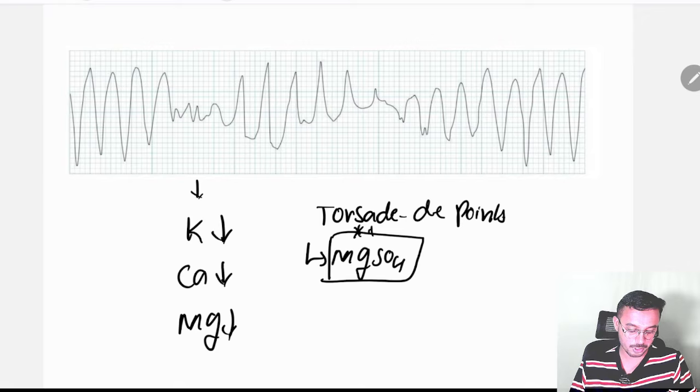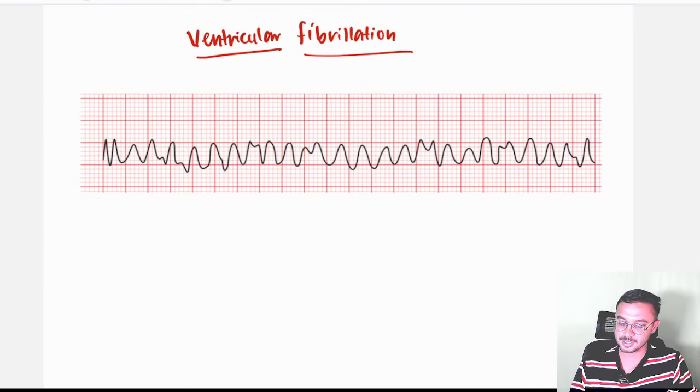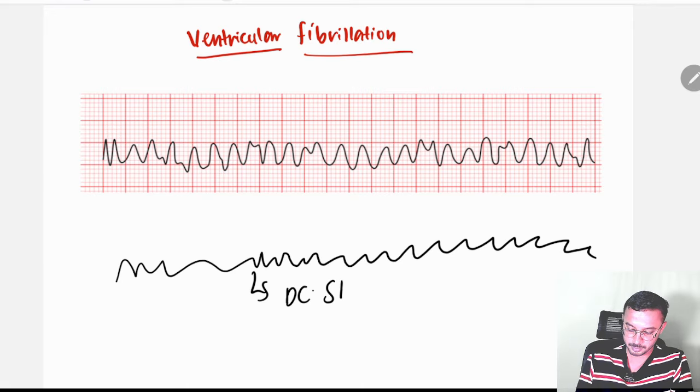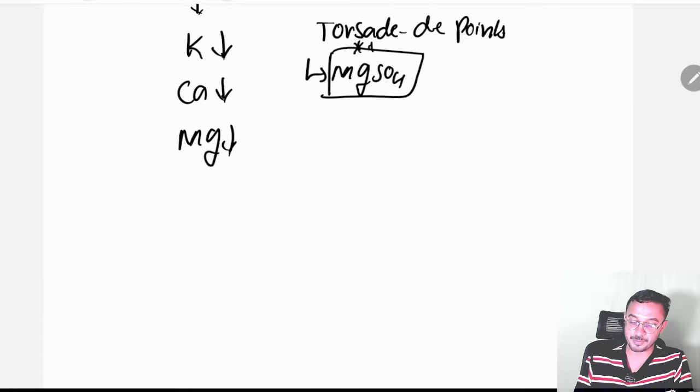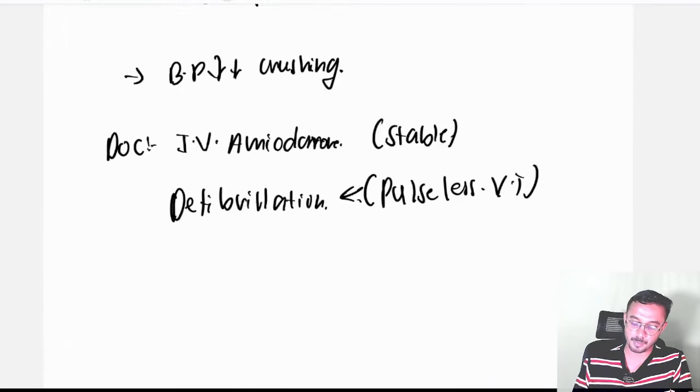And these are all about your ECGs. Here, this is a very simple ECG. This you will be seeing in ventricular fibrillation, and you should hand draw it like this. Ventricular fibrillation: here you should always give a shock to this patient. DC shock is the treatment over here. So these are all about fibrillatory rhythms.